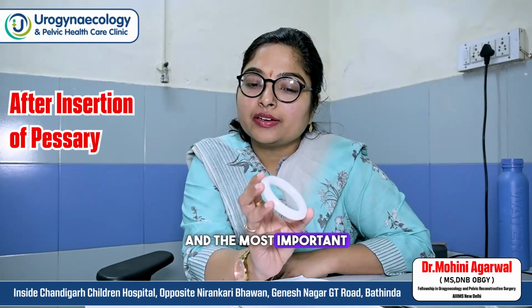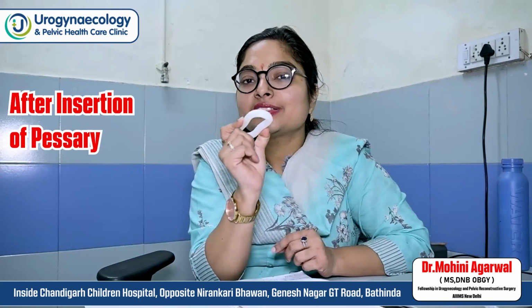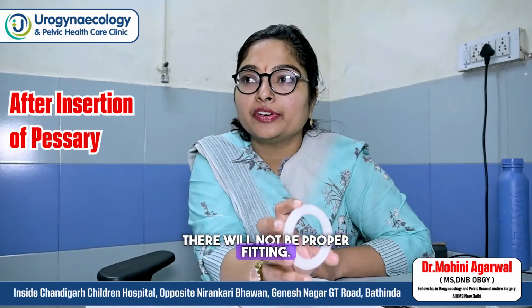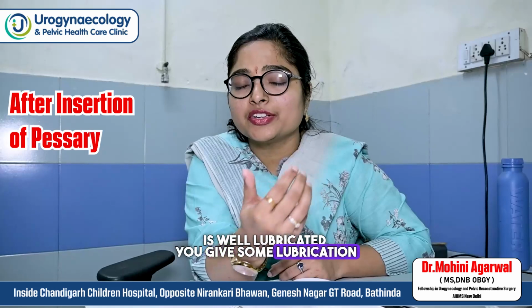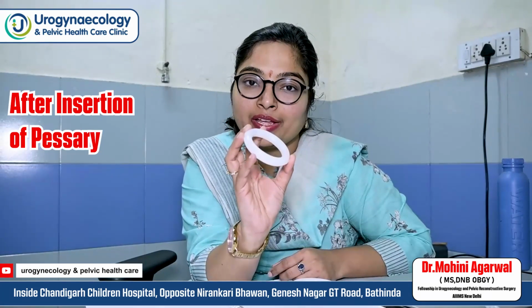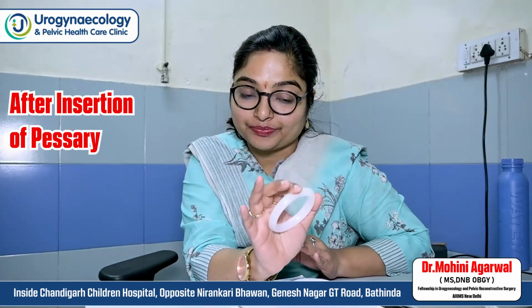And the most important thing is, whenever you insert a pessary, don't lubricate the pessary. If you lubricate the pessary, it will not even stick, and your hands get slippery, so there will not be proper fitting. Make sure that the vagina is well lubricated. You give her some lubrication in the vagina, and you can add lignocaine jelly also. Okay, but you don't lubricate the pessary. So this is how you fit a pessary, and after fitting, you give the patient instructions.